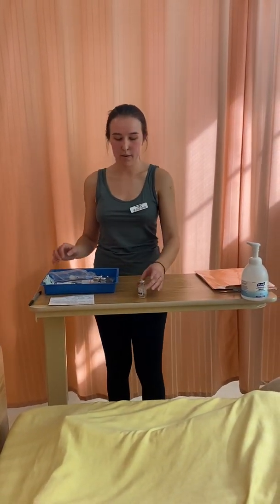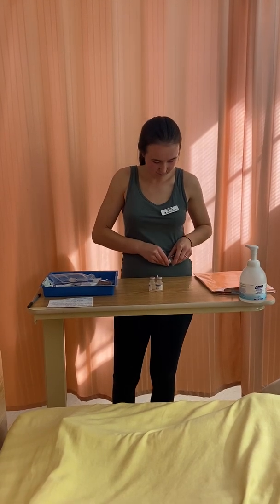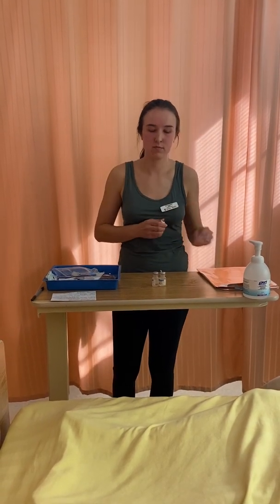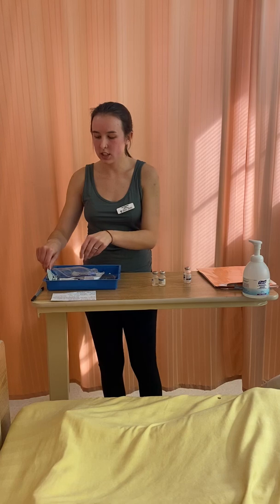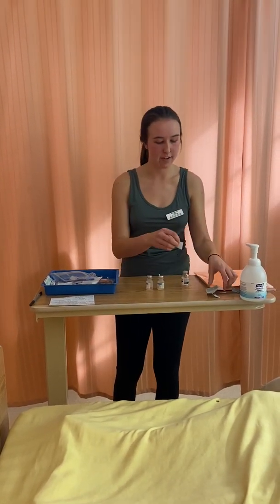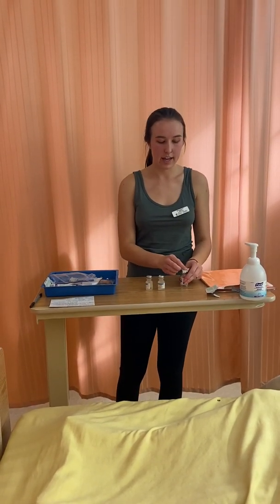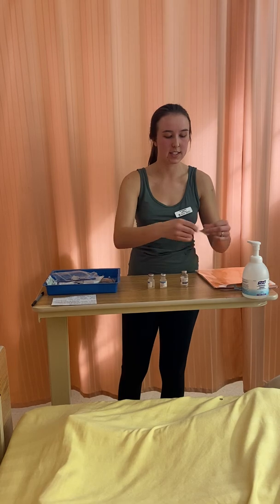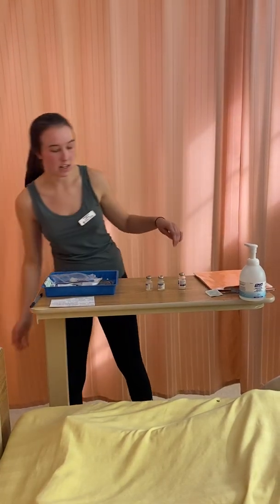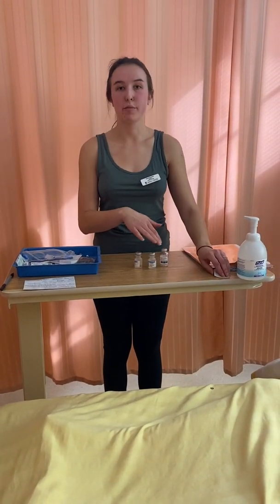So at this point, with my sterile water, I'll wash my hands and open up my vial. I'm going to clean the tops of all of my vials for 30 seconds and let them dry for 15. I would use a different alcohol swab for each vial, letting each dry for 15 seconds. If I had touched one, I would reclean it.